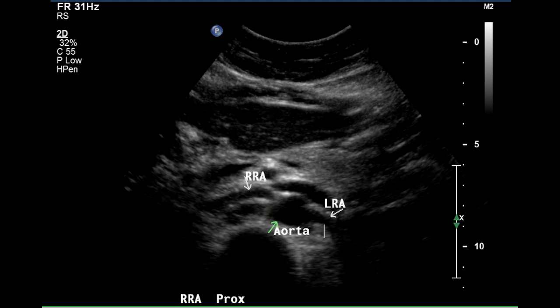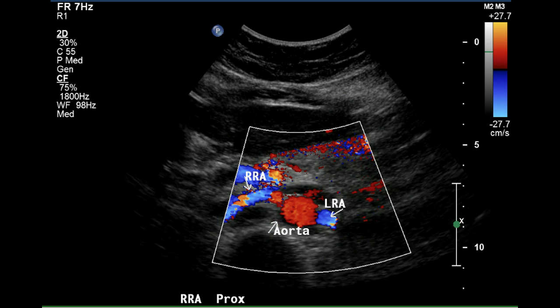This is a grayscale image demonstrating the origins of the right and left renal arteries. They appear to be free of plaque on grayscale imaging. Color Doppler indicates that both vessels fill well with color Doppler, indicating lack of plaque or stenosis.